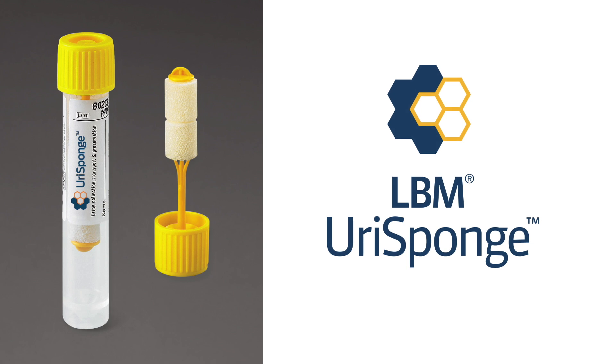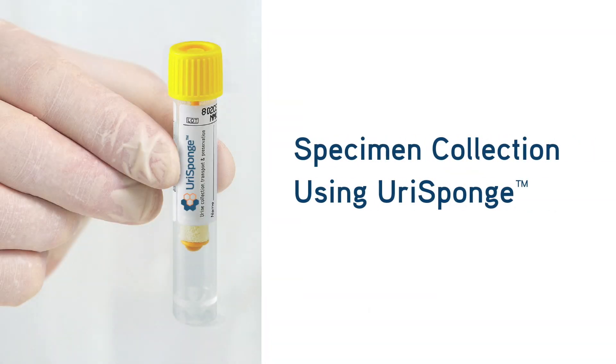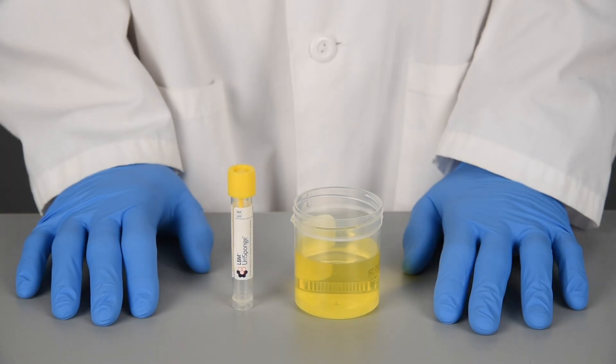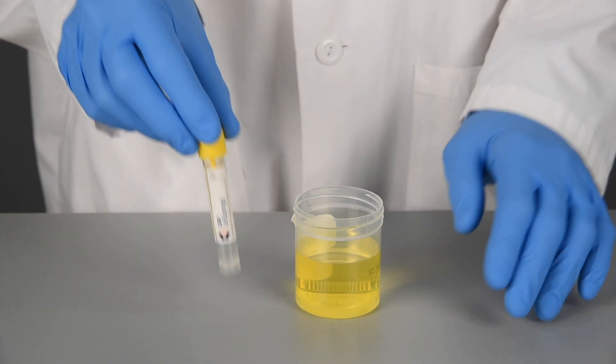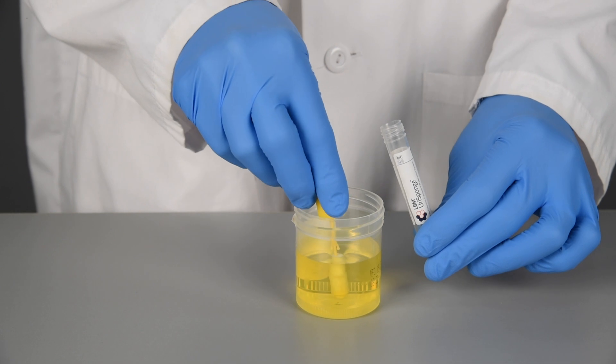Copan UriSponge instructional video: Specimen collection using UriSponge. Obtain a clean catch urine sample from the midstream portion into a sterile container. Open the UriSponge tube and, holding by the cap, dip the sponge applicator into the urine sample.